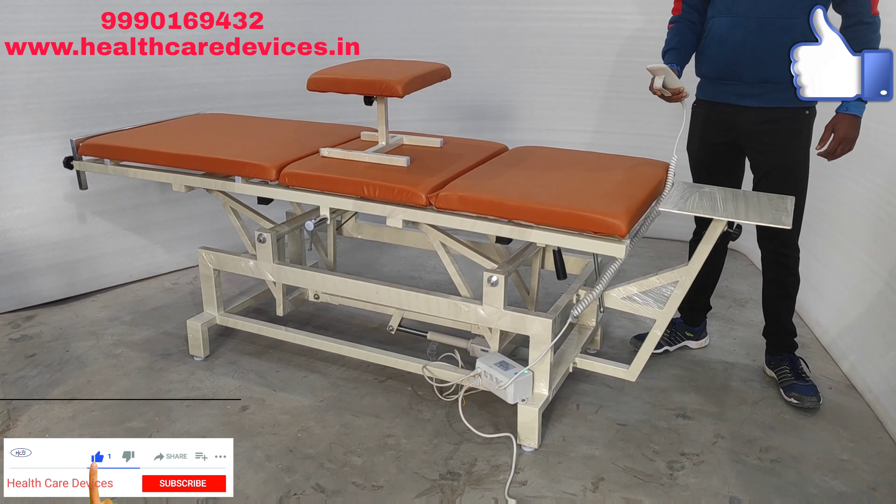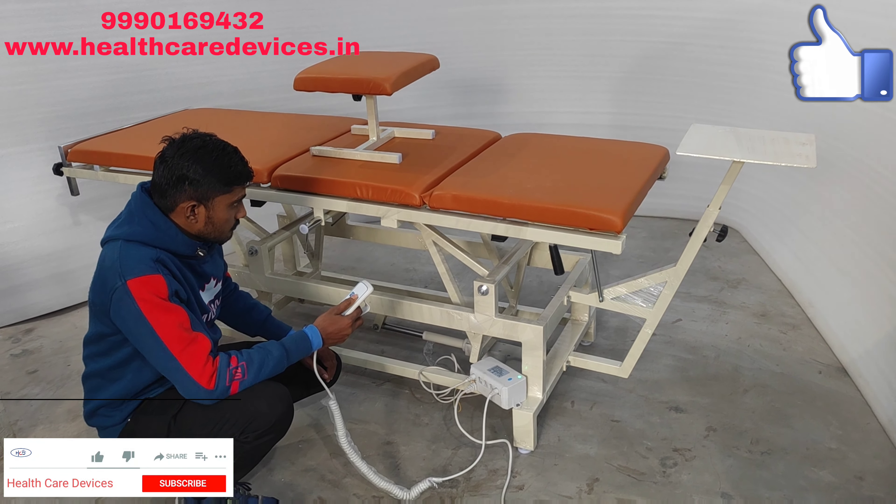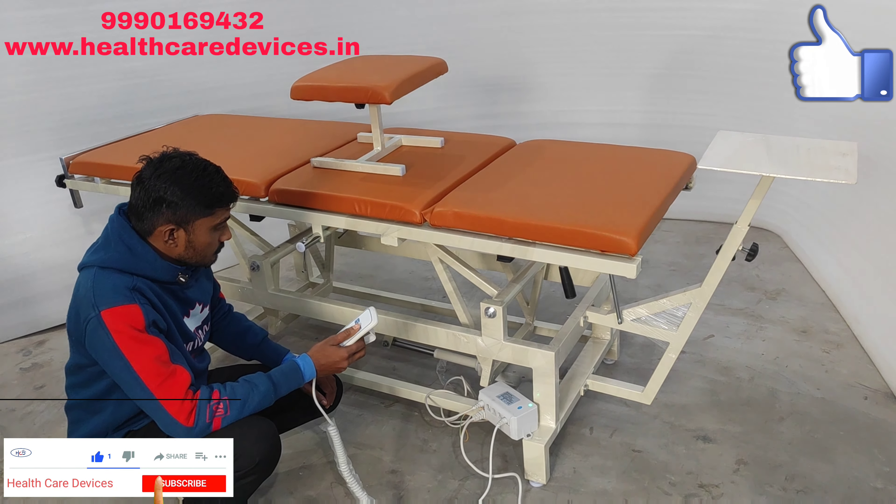Like this, you can see. We have taken it from the high-low bed to show you the demo. Now, like you have to use it in a 3-fold bed, you have to use it in this bed too — just the high-low function will be done.